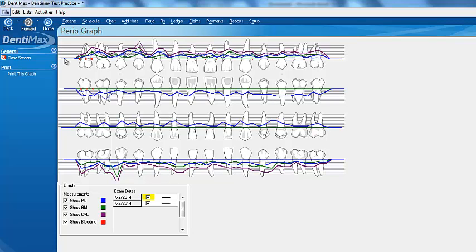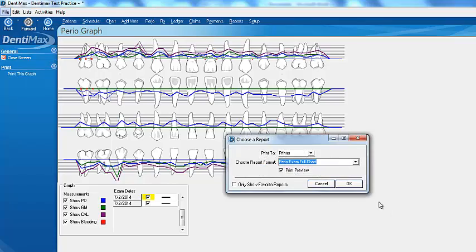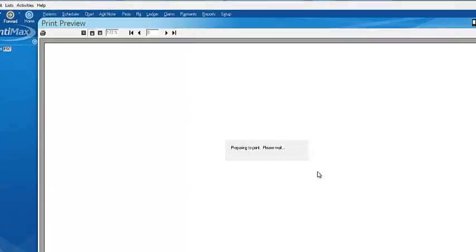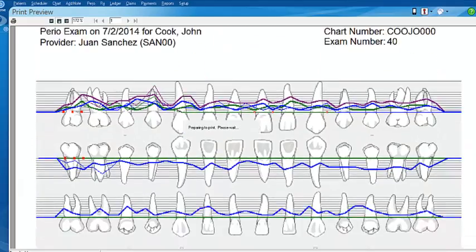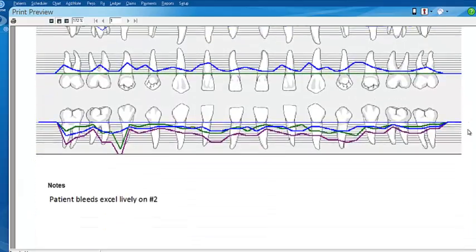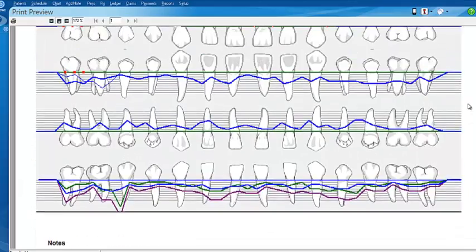From your graph screen, you can also print the whole graph out. Just click on print this graph and say OK. If you have a color printer, it will print out this entire graph in full color.